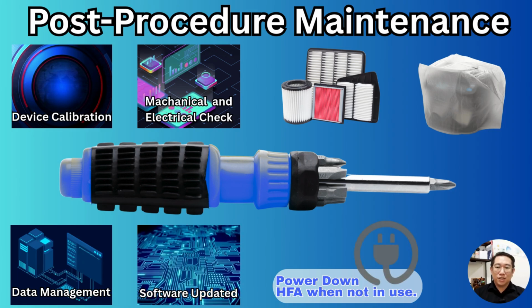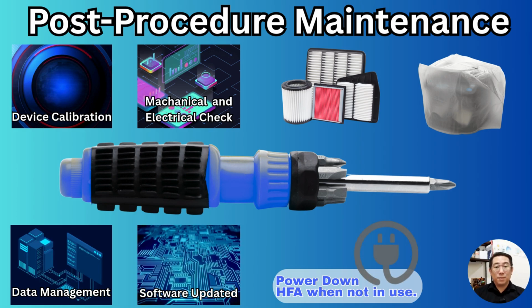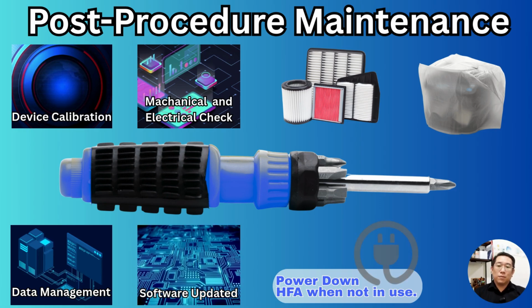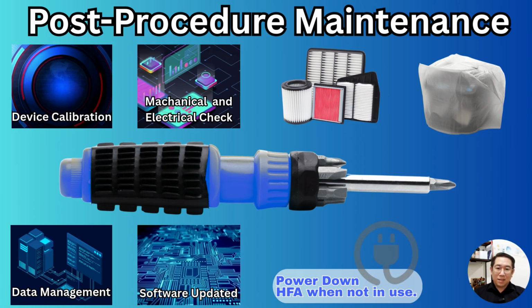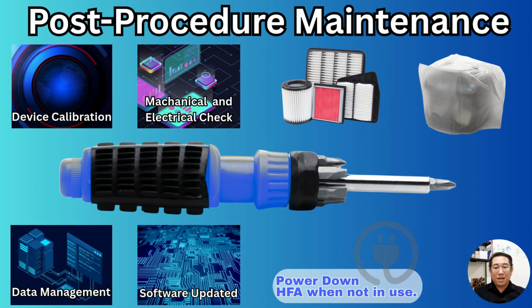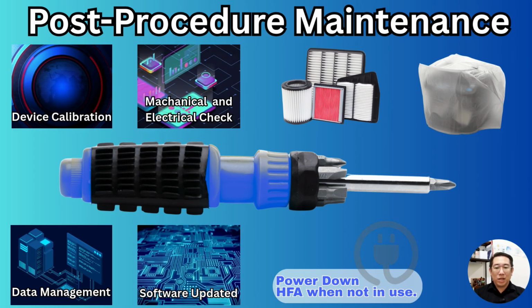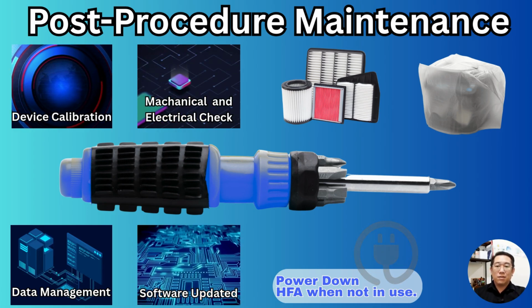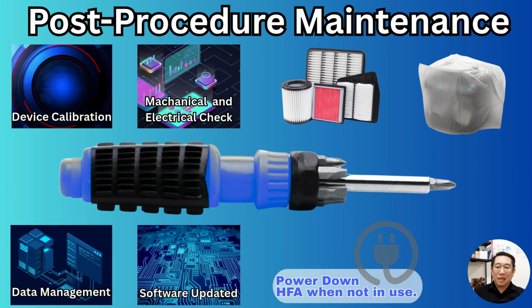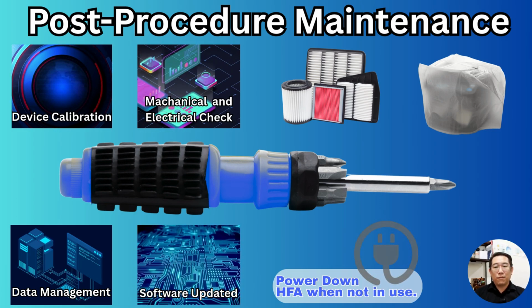My name is Lucas Chanzulong, and now I will introduce the post-procedure maintenance steps for the Humphrey Visual Field Analyzer. Apart from routine cleaning, it is equally important to maintain the device's cooling, calibration, and data system. The air intake filter should be checked weekly for dust and cleaned with a small vacuum, while the rear fan should be kept clear using a soft brush to ensure smooth airflow.